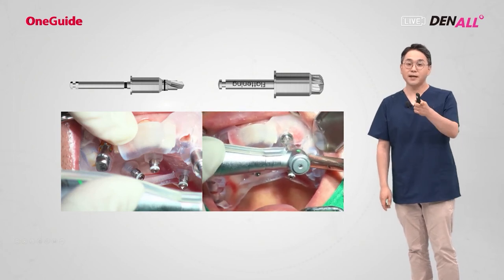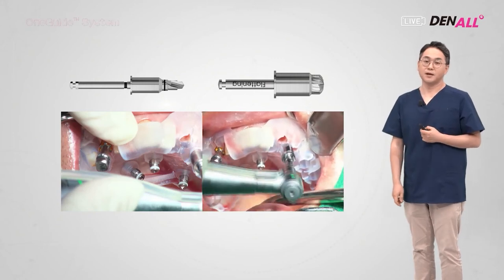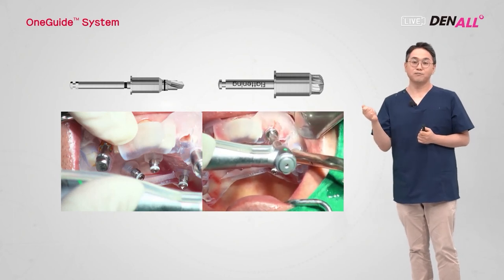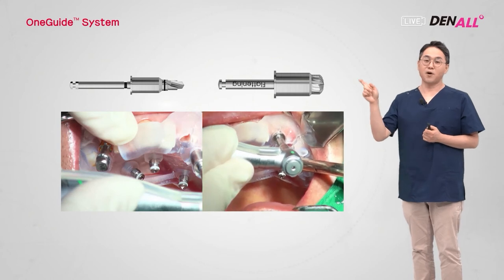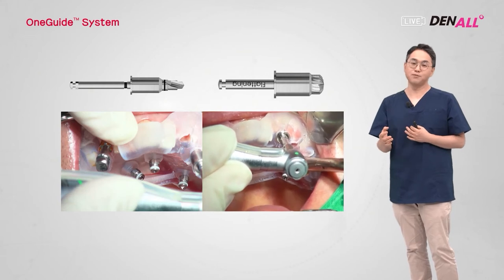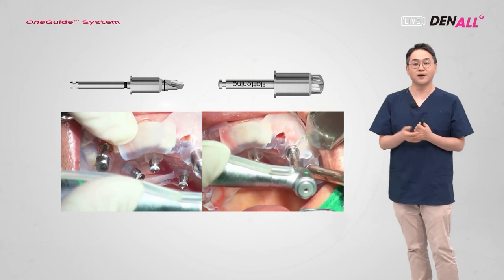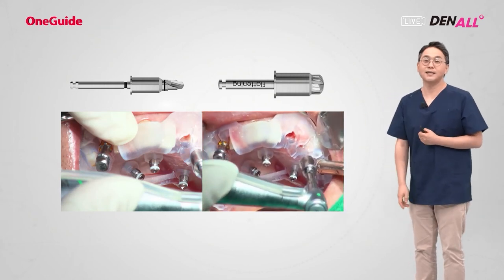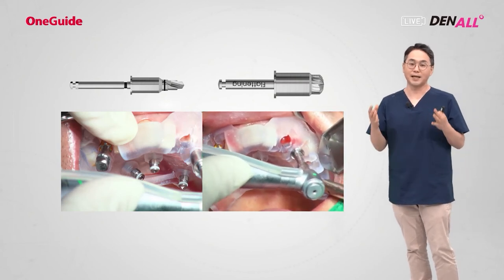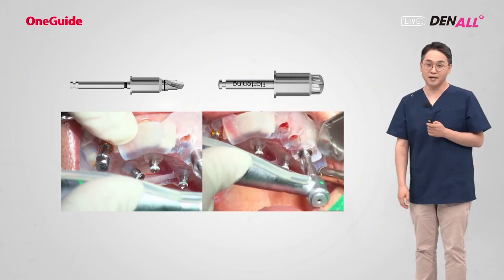Don't be alarmed. Use the flattening drill to grind the cortical bone like this. The crest of cortical bone is expanded. If you use the initial drill again, it will go down to the full depth, meaning the stopper of the drill will go down and reach the top of the guide hole. When you place it in the upper anterior, when it is planned to go deep subcrestally, when gingiva is thin to secure the biologic width, this can happen. Using the flattening drill properly, initial drilling will be done smoothly. Then the subsequent drilling will be no problem as they follow the initial drill path.